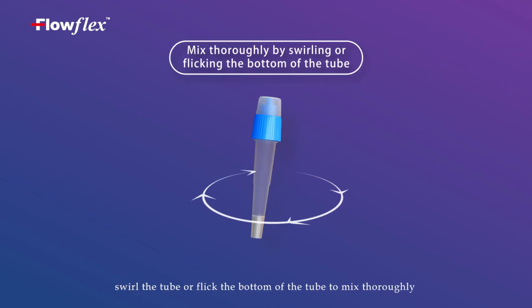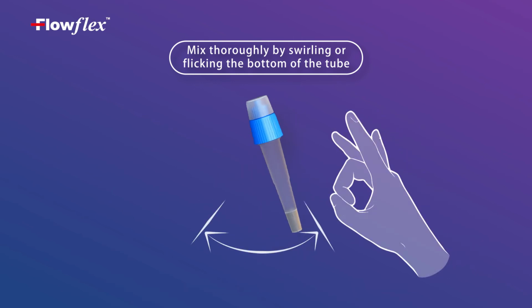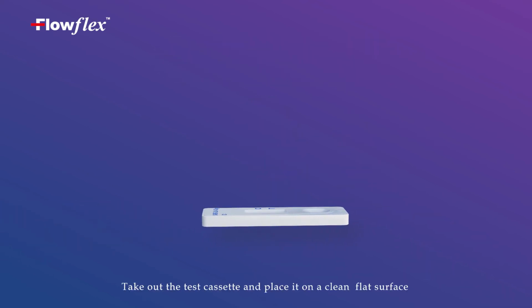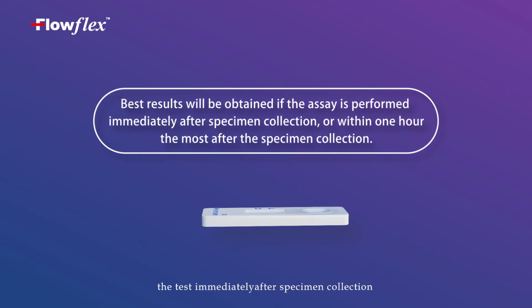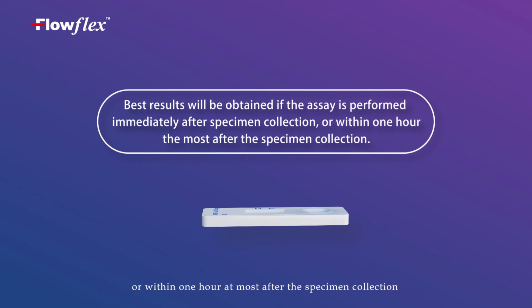Swirl the tube or flick the bottom of the tube to mix thoroughly. Take out the test cassette and place it on a clean, flat surface. For a good result, it's highly recommended to perform the test immediately after specimen collection or within 1 hour at most after the specimen collection.